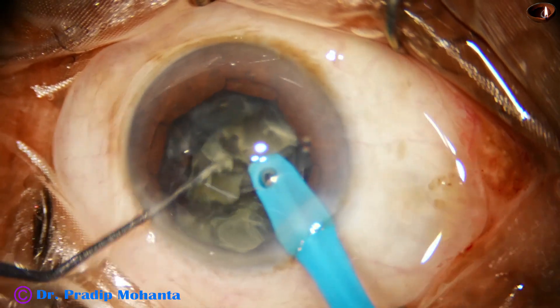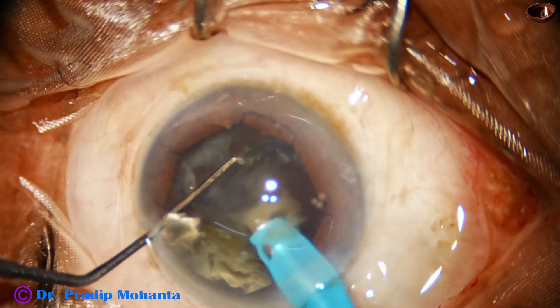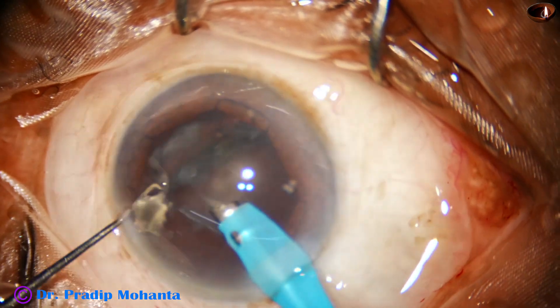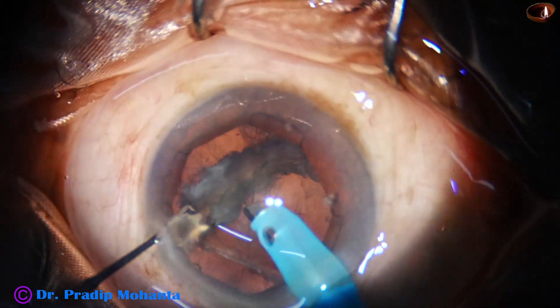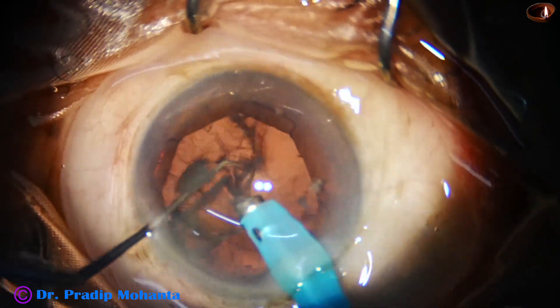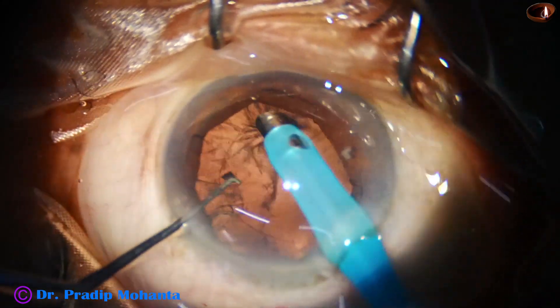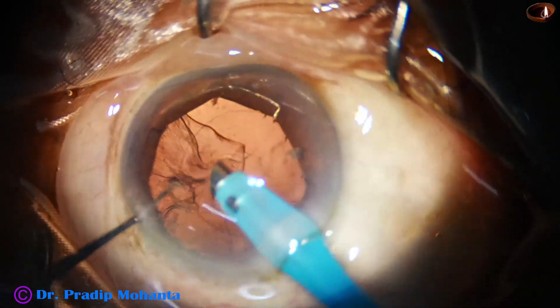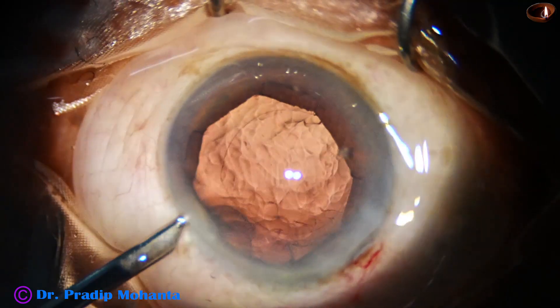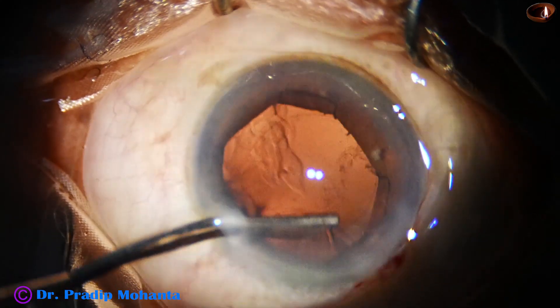See what I am doing for the last two fragments — I am peeling off the epinuclear shell and removing the nucleus only. After that, I go to stereo coaxial mode, visibility becomes better, and we remove the epinucleus. A portion of the cortex is also being removed by the handpiece itself, but cortical removal is your choice — you can do whatever you like.